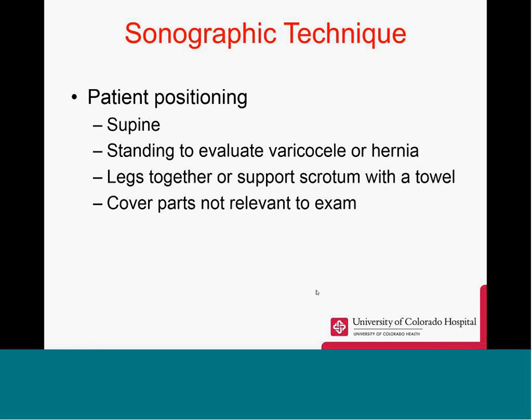Patient positioning: we're going to have the patient be examined in the supine position. The scrotum is elevated and the penis is placed on the patient's abdomen and covered with a towel. It is helpful for the patient to localize a palpable nodule within the scrotum.